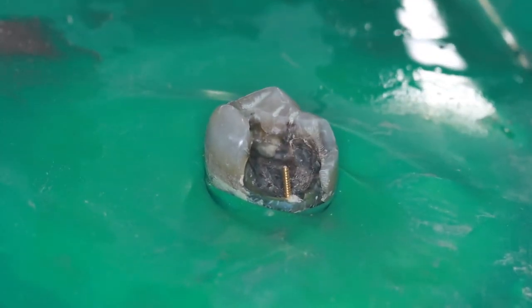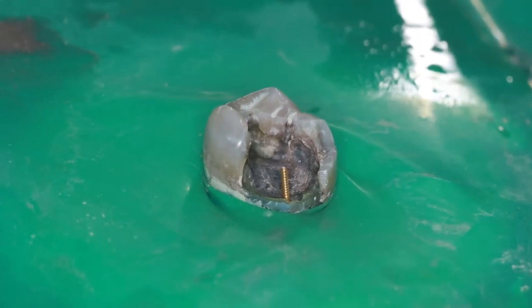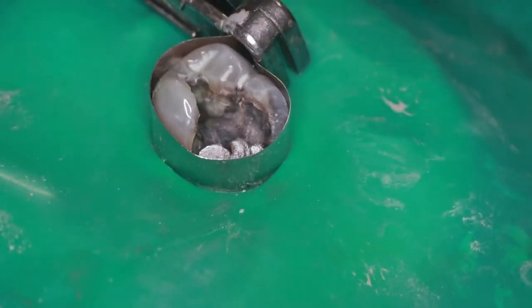Once the pin is in place, sometimes I give it a little tweak with a bending instrument to make sure that the top of the pin will be inside the filling material placed over top of it. Now I can place a filling and the dental pin will hold it in place.